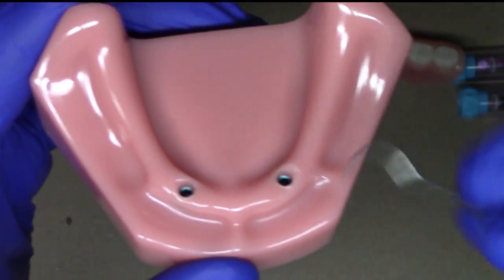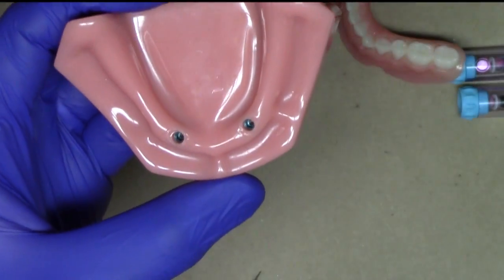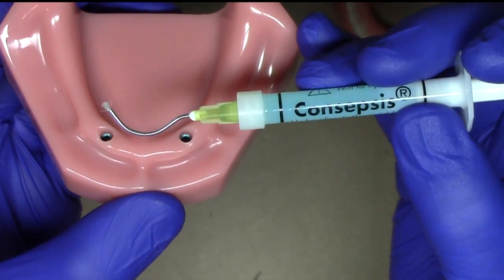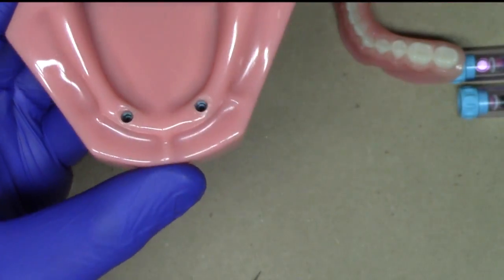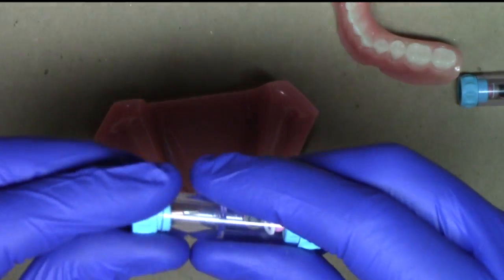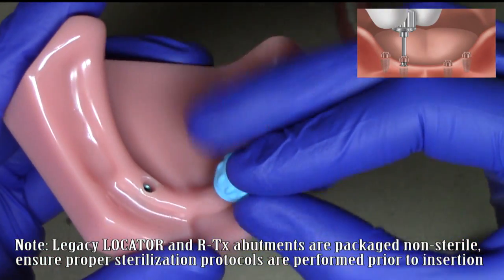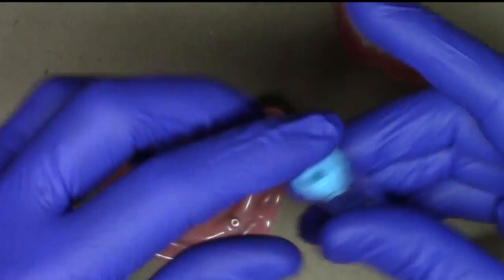Confirming the sizes, I use a periodontal probe to measure the soft tissue height all the way around the implants. Then I use an irrigating syringe with sterile water or a material such as Consepsis, which is a specialty type of chlorhexidine irrigant. I like to use that prior to placing any implant abutments to keep things fresh. I've already sized my locator RTX abutment, it's been put through a cold sterilizing solution, and now I'm going to place it directly onto my implant, and place my second one.